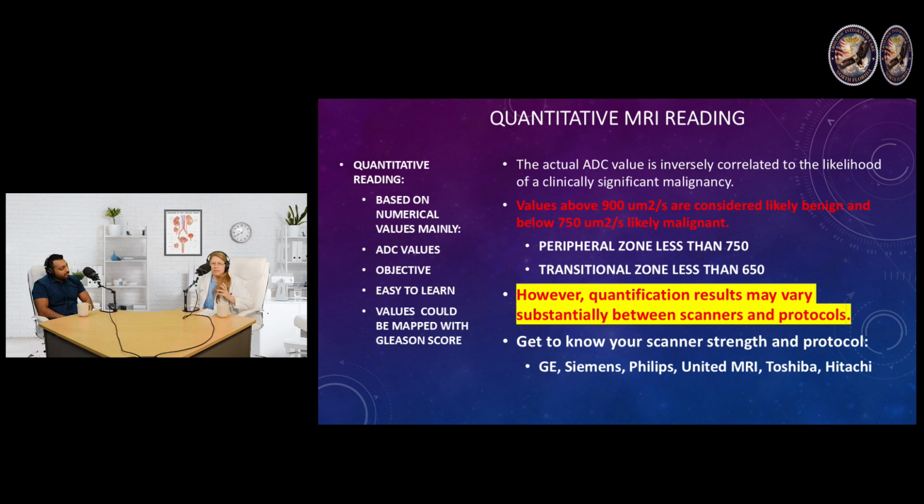It's easy to learn. I have a few students training, and they come to learn how to read MRIs and learn about this new methodology. Actually, it's not very new. It's been there, and I just saw a few publications this year in 2025 on how to use ADC values post ablative technology treatment, which is very interesting.